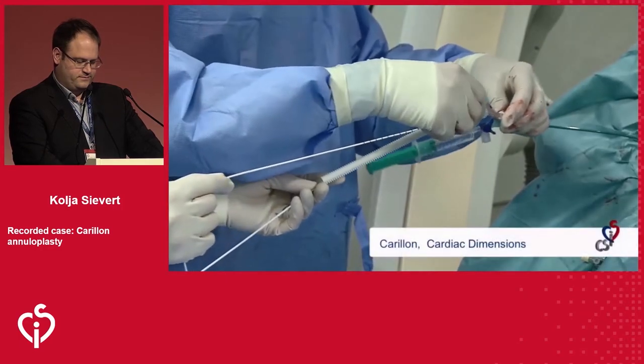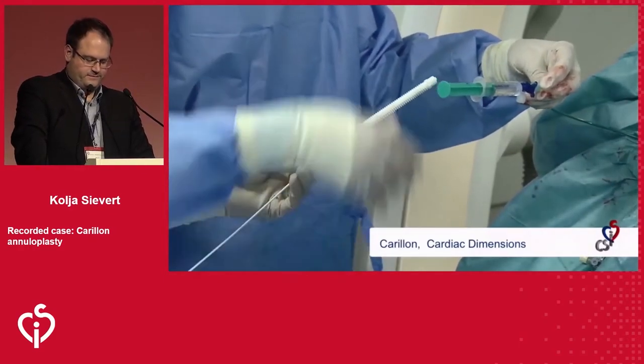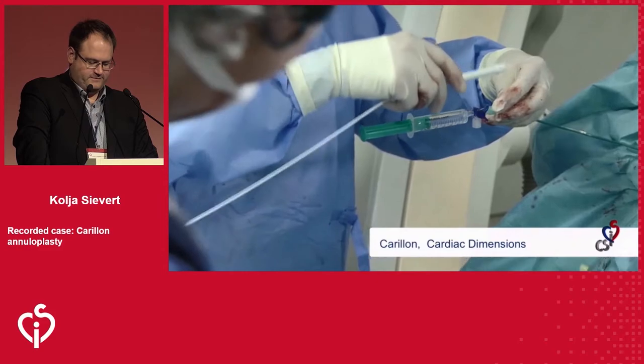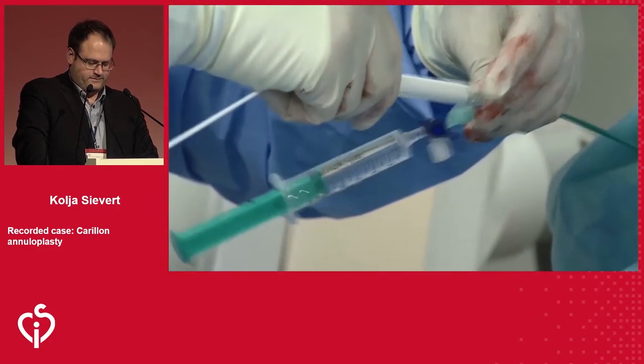So now I'm retrieving the diagnostic catheter, screwing off the Y connector. This is the only device you can use in cardiology where there's no need to flush at all.